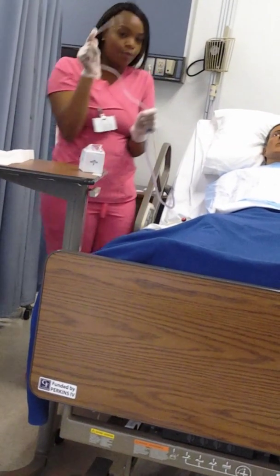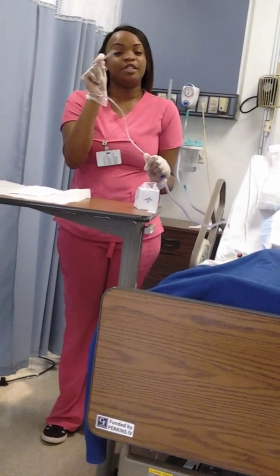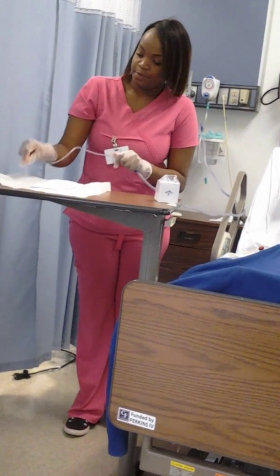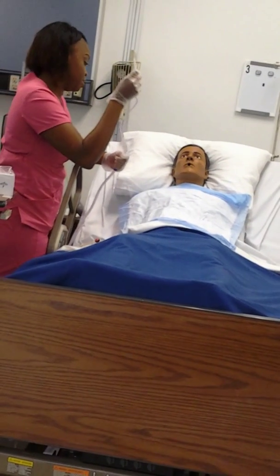But before I go in, I want to lube. I'm going to only lube 1 inch. I'm just going to only lube the tip because once you get the lubrication, it gets a little lubey and wet. I'm just going to go ahead and lube. It's still sterile. Okay, Mr. Jones, we're getting ready to go in, okay?